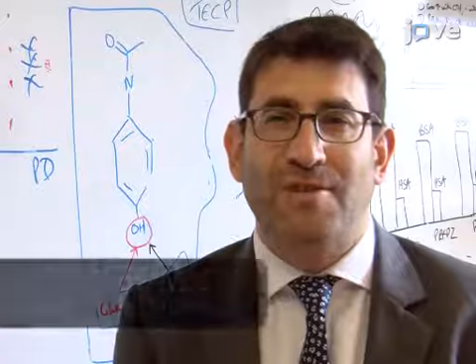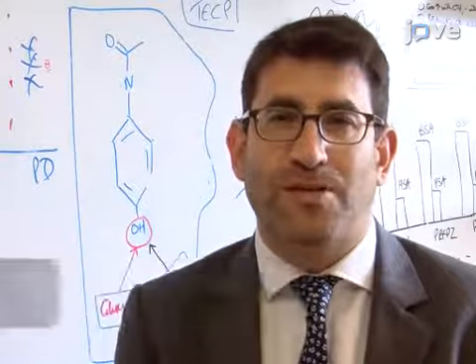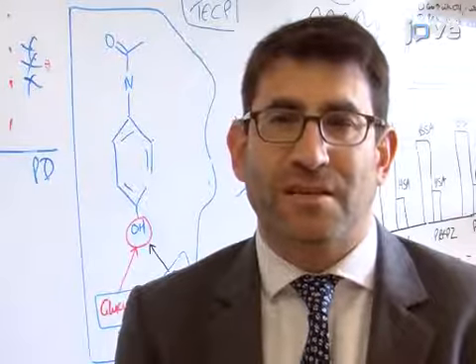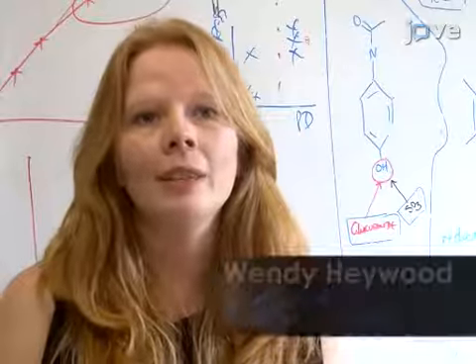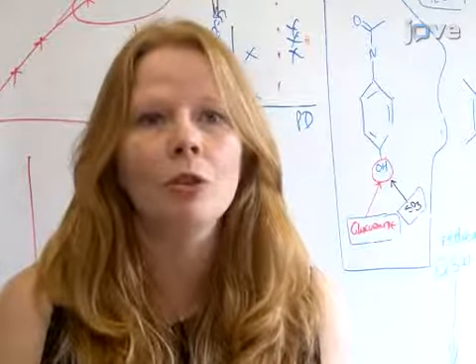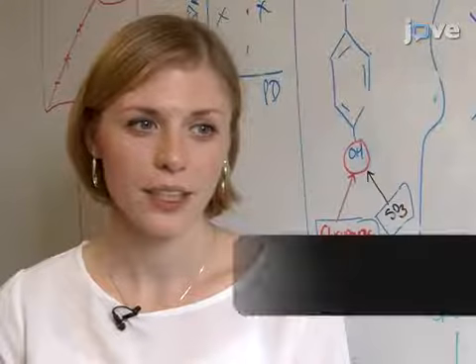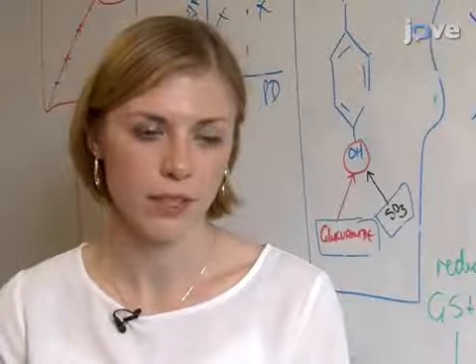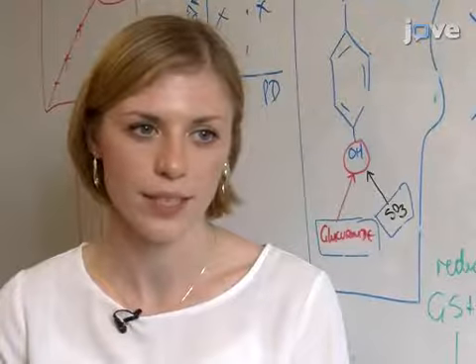also give prognostic information. The main advantage of this technique is that it's designed to be rapid, simple in sample preparation, highly specific and cost-effective for translation into the clinical lab. The implications of this technique extend toward therapy or diagnosis, as this high-throughput test can be used in future clinical trials for novel therapies in neurodegeneration. This methodology can also be applied to other diseases and tissues, such as urine for kidney disorders, plasma for cardiomyopathy, and cells for pluripotency.